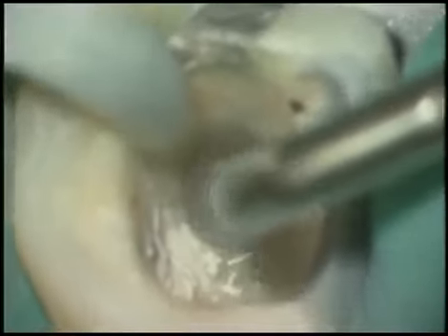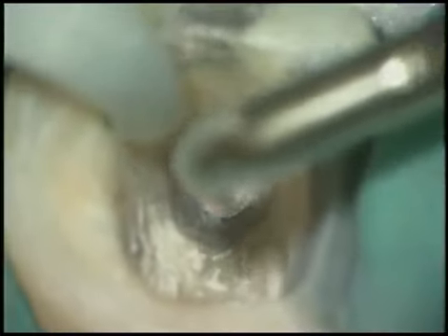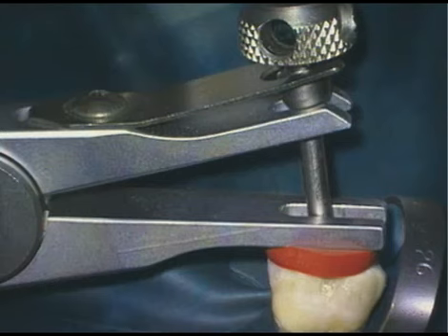It is axiomatic that cement will lie apical to the post. Eliminate it with ultrasonics. Now refer to another tape in the retreatment series on gutta percha removal. In this show, we have seen the PRS in action several times.